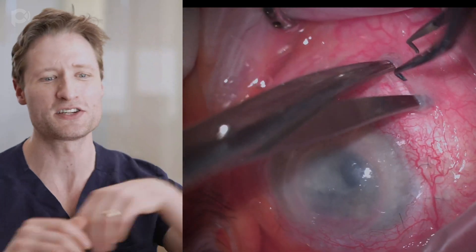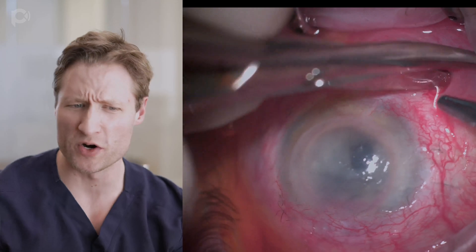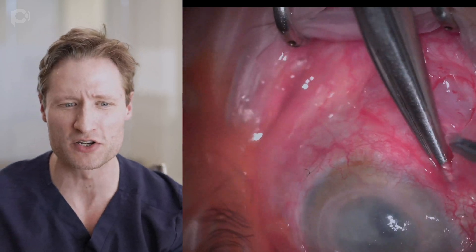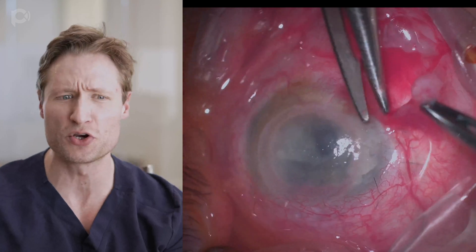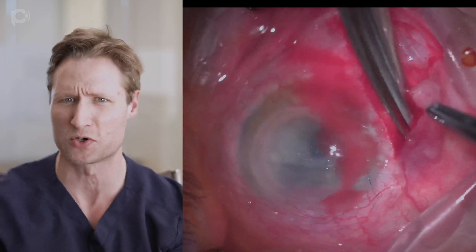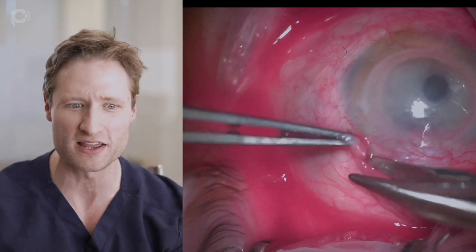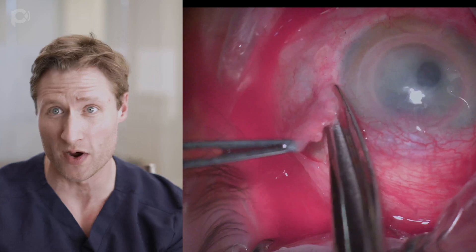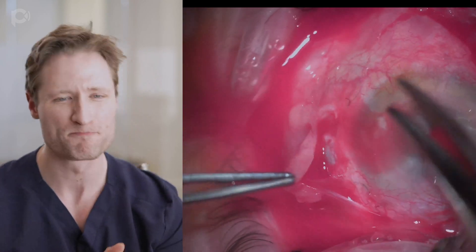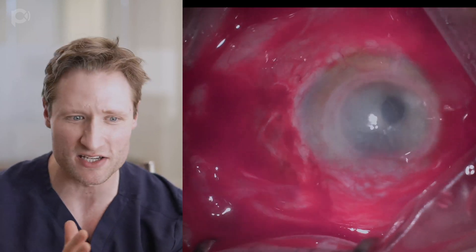This is a complicated eye. This is a patient that has a failed previous PK and the cornea is edematous. There is some kind of IOL in this eye, but it is grossly dislocated. The whole thing is cocooned up in fibrous tissue that makes the anatomy difficult to discern. We're going to try to refixate the patient's existing IOL or put a new lens in the eye and then also rehabilitate their cornea with a DMEK. We start by making peritomies nasally and temporally.